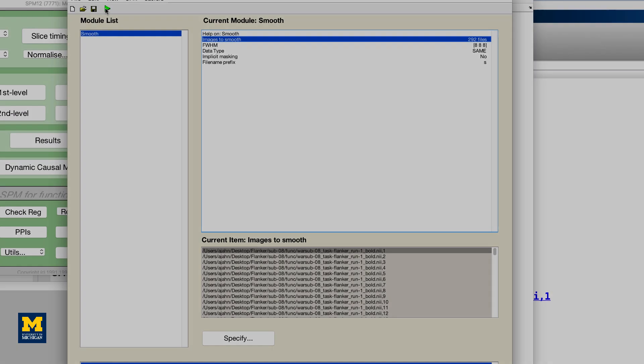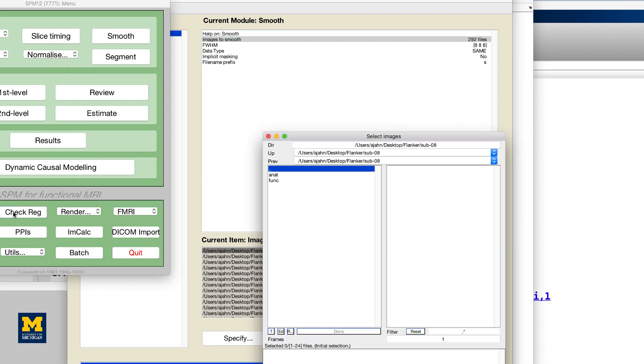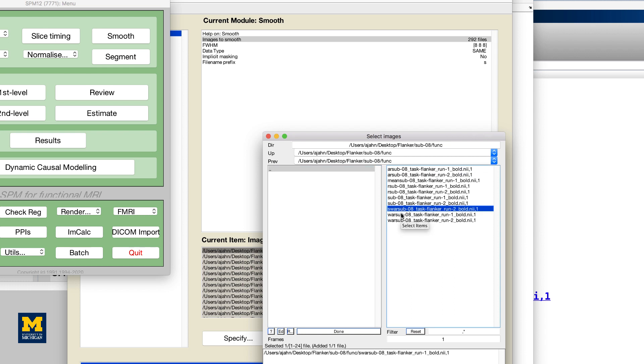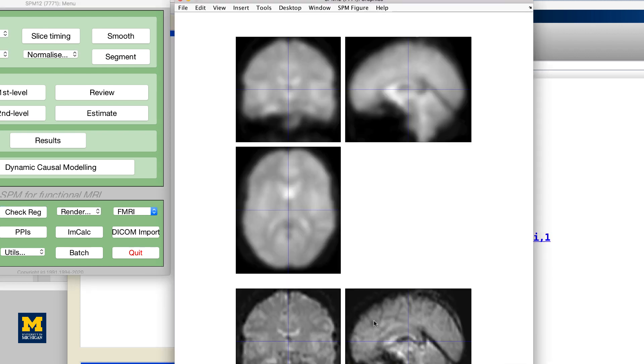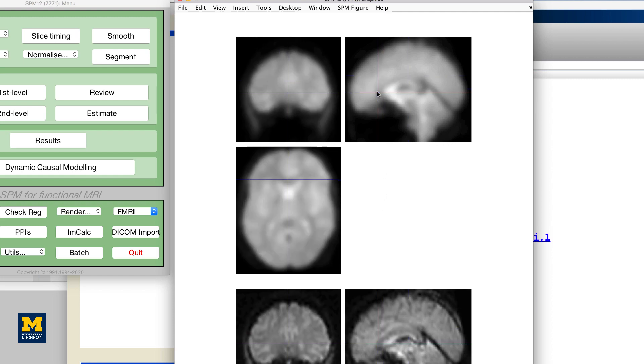As before, use the check reg button to load a representative volume from the output you just created and view it side by side with a warped functional image that hasn't been smoothed. Make sure that it looks that it has been smoothed by the amount that you specified.